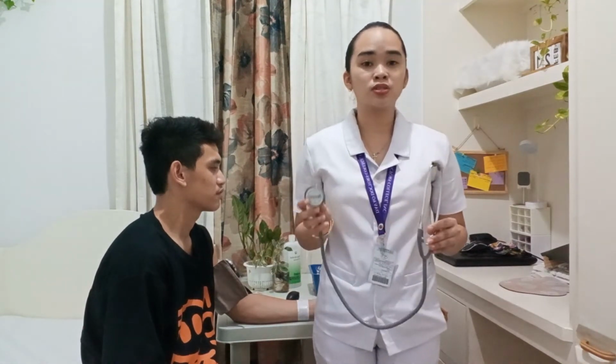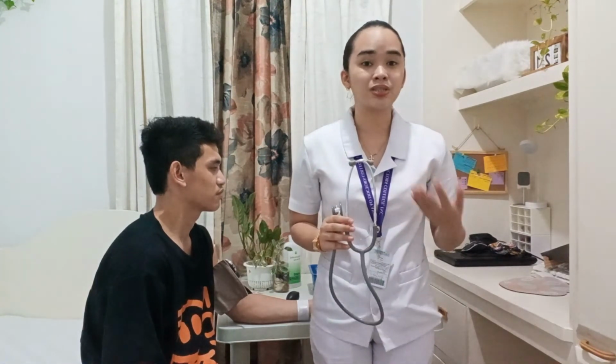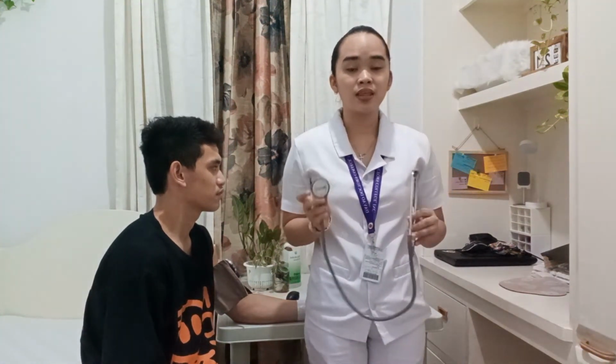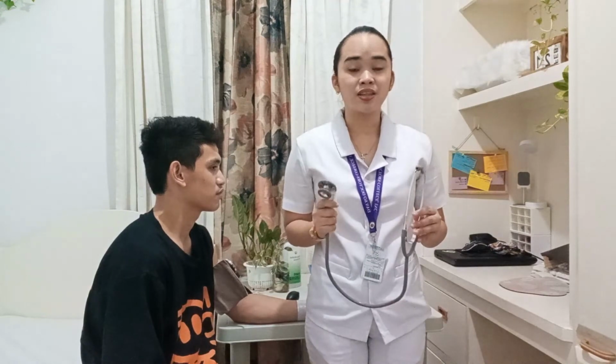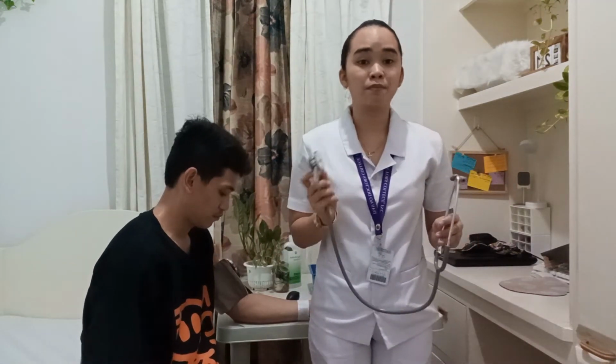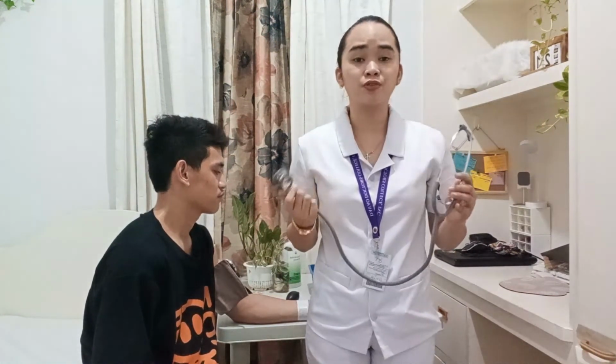And also, I'm going to use the bell part of my stethoscope because the bell is best used for low frequency sounds such as our blood pressure. Now I'm going to place the bell towards the pulse site or the brachial pulse site. Also remember that it is important to place the bell directly onto the skin, not on the cloth over the site, for us to avoid the sound made from rubbing the amplifier against the cloth.